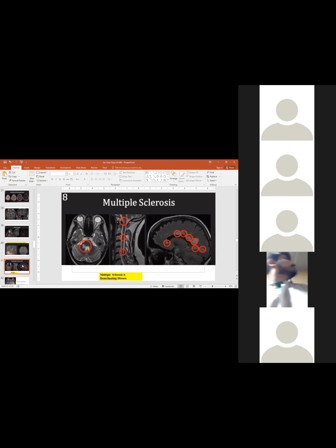Now, another very common pathology is the disease known as multiple sclerosis. It is a disease with varying types of symptoms, as it is a demyelinating disease. There is demyelination of the fibers of parts of the brain, and this demyelination leads to many-fold symptoms. In one of those cases, we picked up a bright signal here in the cerebellum.